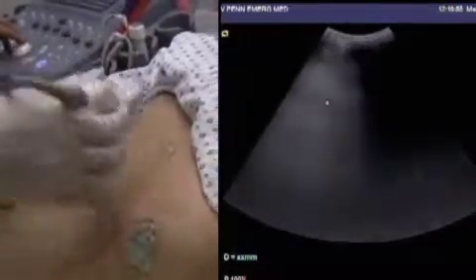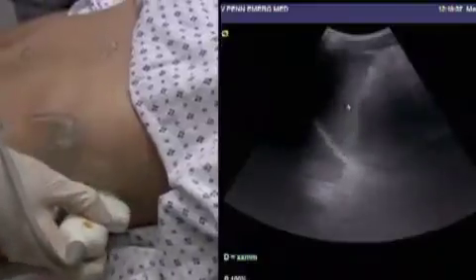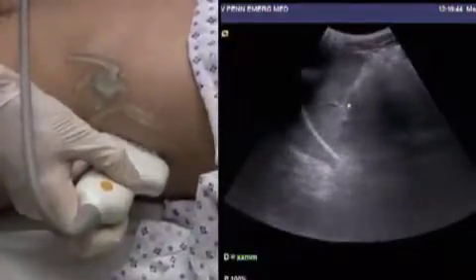Moving over to the left upper quadrant now, we're going to orientate the probe parallel with the ribs again. We might need to make some adjustments for depth because this is a much more superficial view than the sub-xiphoid view.